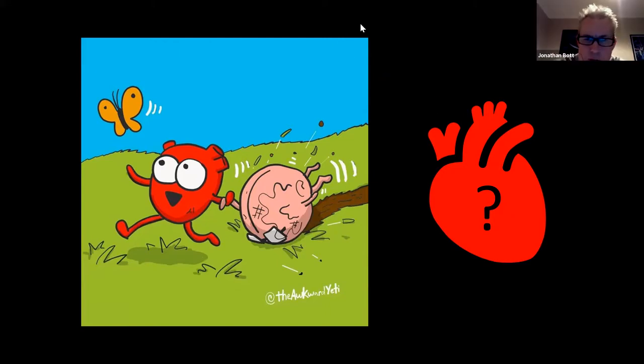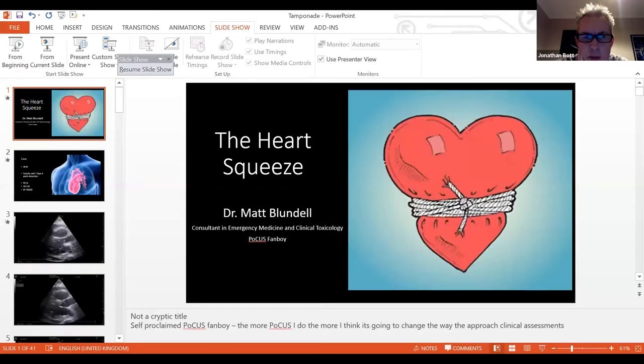With the ultrasound-guided pericardiocentesis that you were just describing, where you said you can get better views putting the patient in the apical four chamber position, where are you then introducing your needle, or is it dependent upon what you see? It depends on where you find the biggest pocket of fluid. If you roll them onto the left-hand side with your ultrasound probe, you can fan around and find the biggest pocket, and then you're doing it under ultrasound guidance. So you can't say there's one particular landmark you're going to go for. It's just where the biggest pocket is.